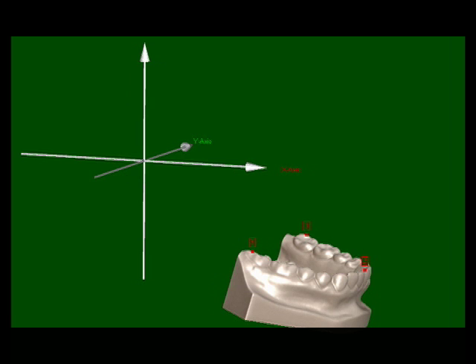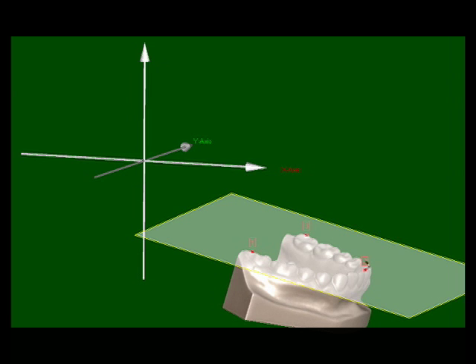Unmounted cases are articulated using average anatomic values. First, a lower occlusal plane is defined and set at an angle to the horizontal. A hinge axis is then located at a specific axis incisal distance and vertical height.